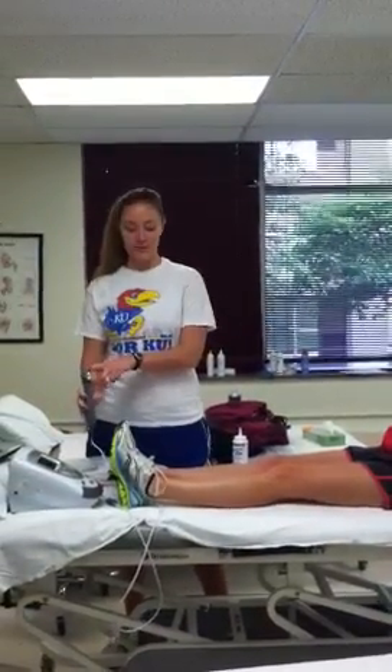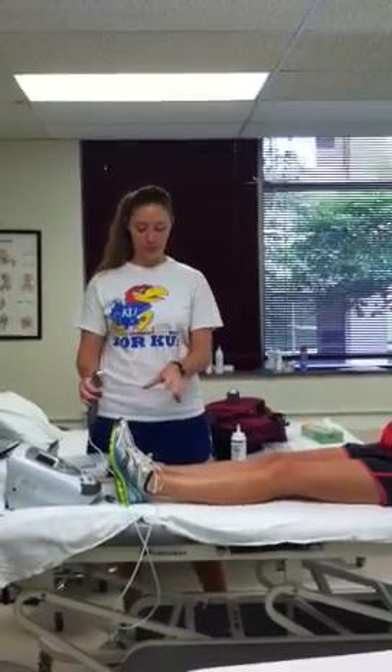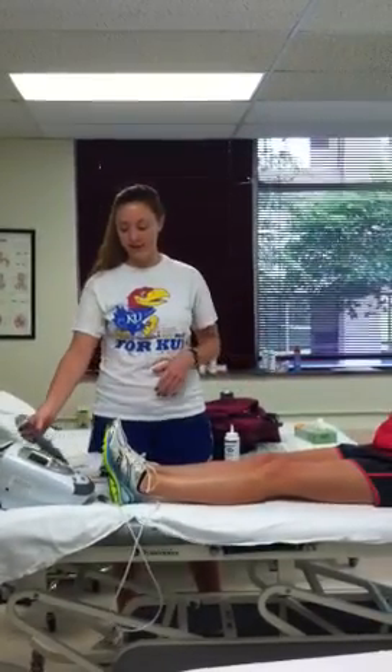If the wound is really big, you still only want the treatment area to be about one and a half to two times bigger than the actual head of the ultrasound. So if it's really big, you have to take it in parts — do one part of the wound and then another part, and so on.